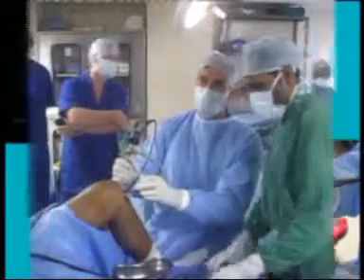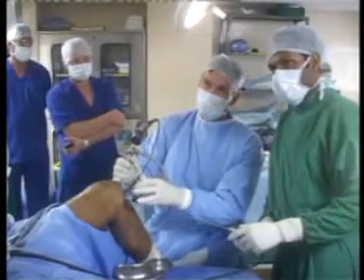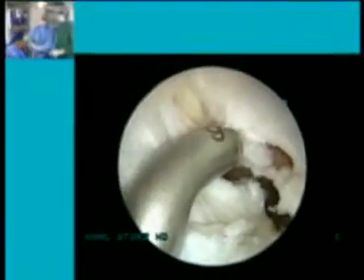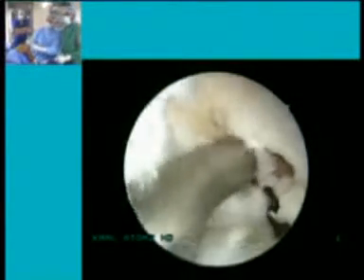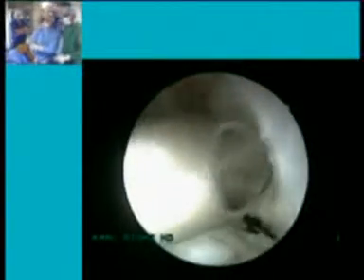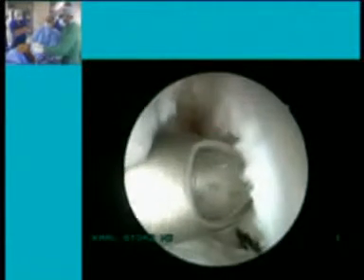Can you hear me in the auditorium? Yeah, Dr. Wolf, we can hear you, okay, and see you as well. Now I continue with the femoral tunnel. Yeah, if we can have the inside picture. We have a specific aimer for that, an offset aimer with a pin. In this case, I use a 9 millimeter offset. The patient is 179 centimeters tall, and I put the pin into this hole of the AM tunnel.